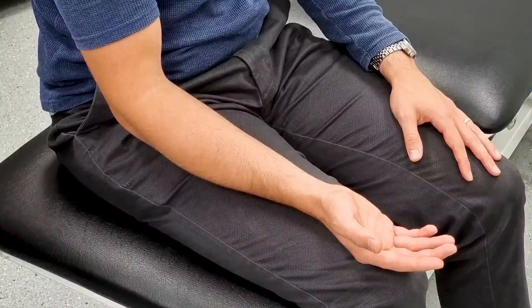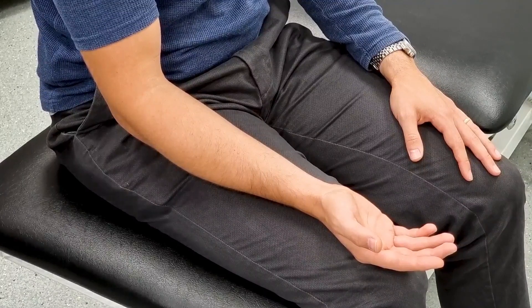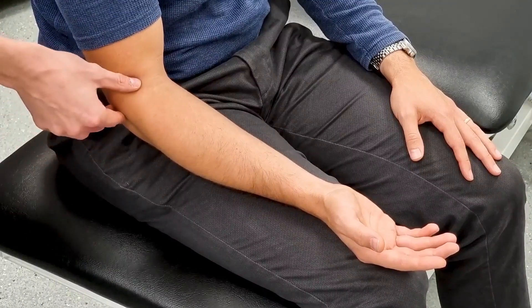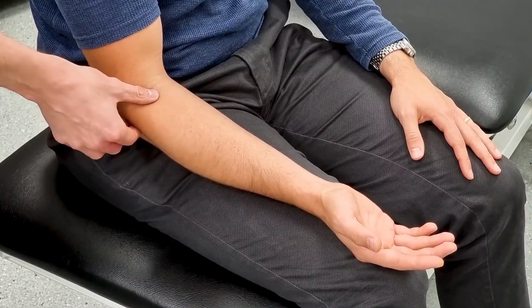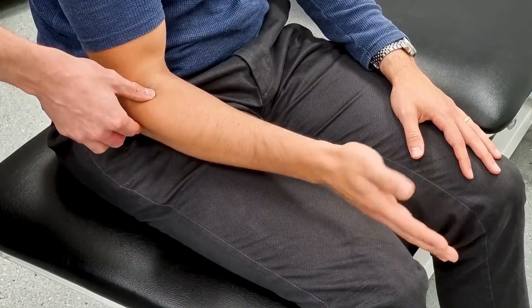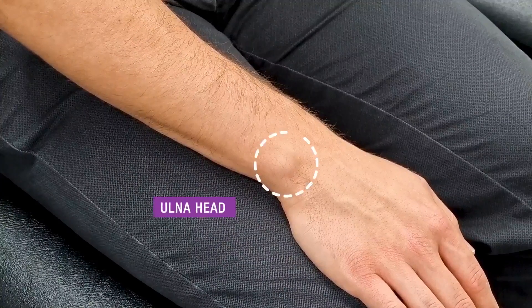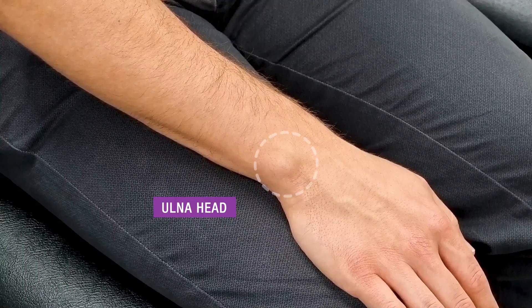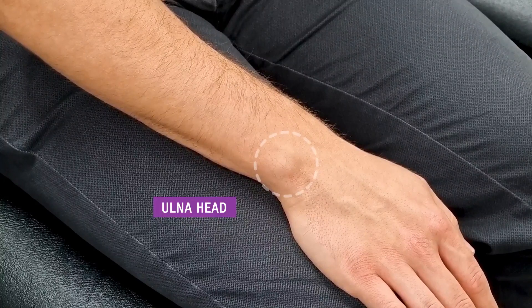Now we are going to demonstrate some of the structures that we saw on the model on a real patient. The first structure we can identify is the radial head. The easiest way to do this is to identify the lateral epicondyle of the humerus and move a centimetre or two distally. You will know you are over the radial head because if you ask your patient to pronate and supinate their arm, you will feel the rotation of the radial head underneath your fingers. The other bony prominence easily identifiable in the forearm is the ulnar head, seen in the distal part of the forearm, almost at the wrist.